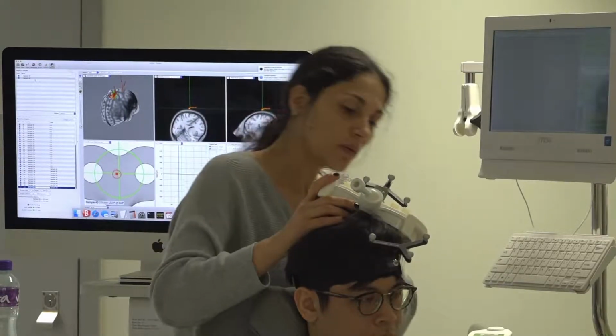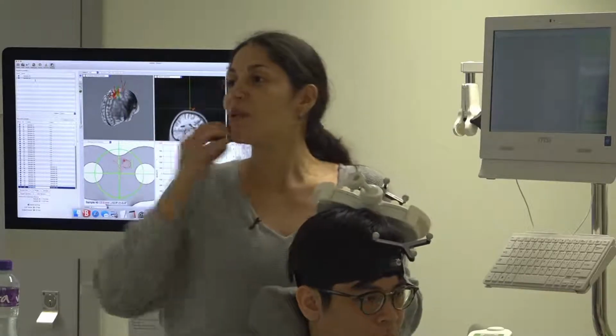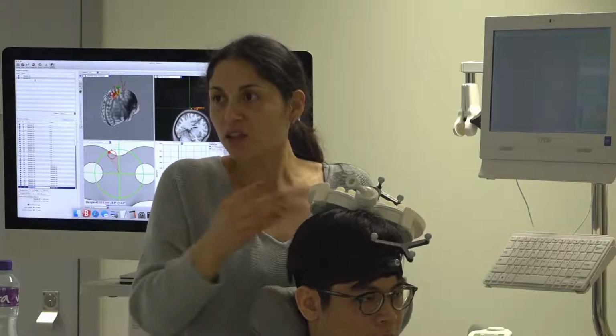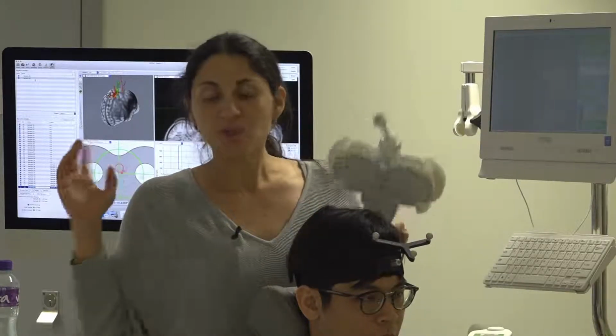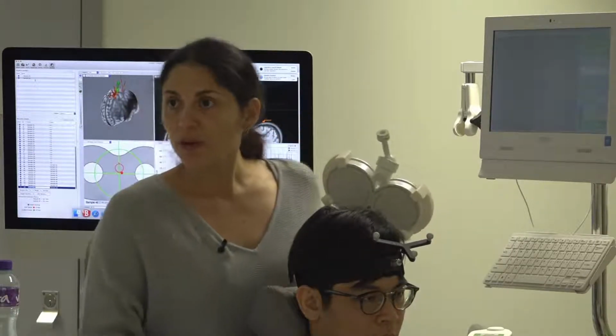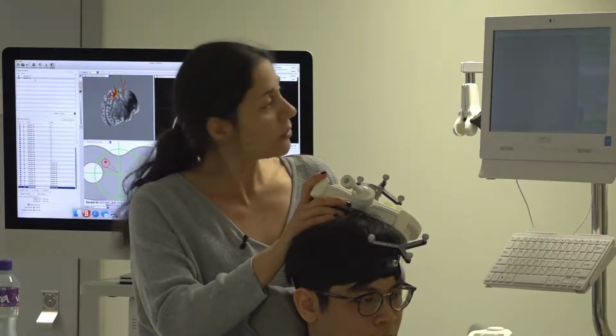Yeah, I lost it. You don't need it because probably what happened there is I stimulated some cells that are not my hotspot, but I could move the finger. So you see several things. The response here and the response in the finger. Yeah, so let's check the response in the finger.